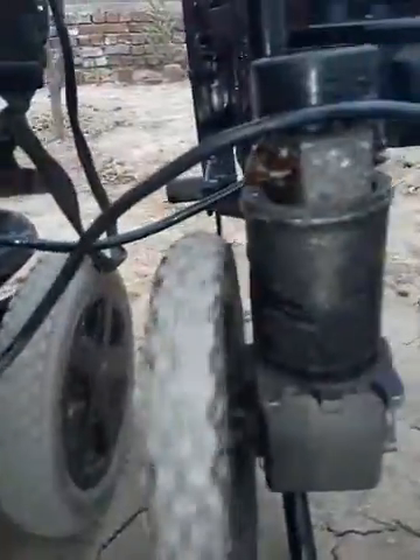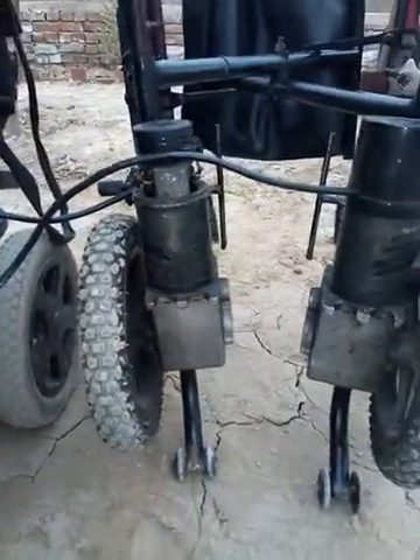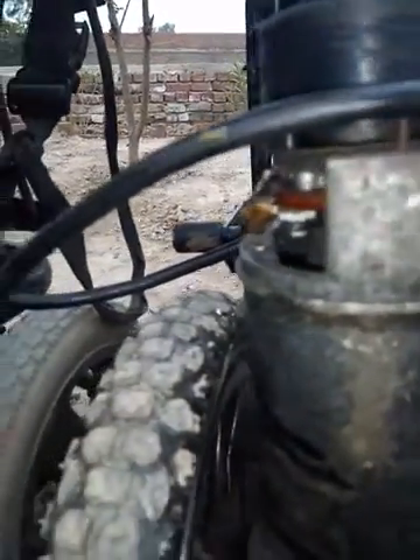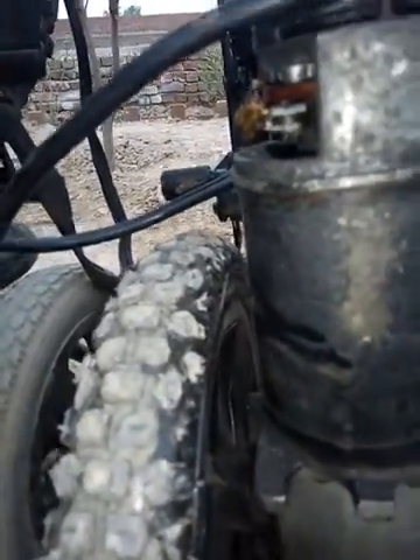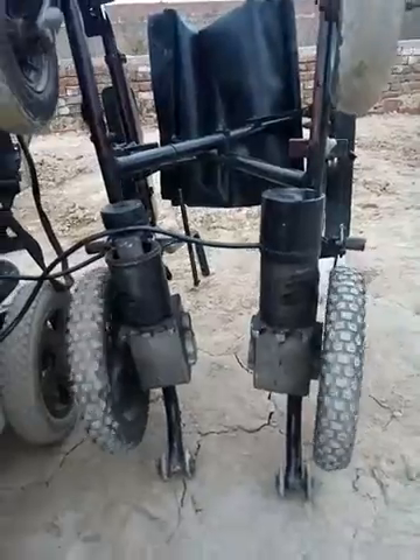You can remove the fault sometimes by cleaning those carbons and checking all the cables with the help of a multimeter, and looking for any disconnection. I have done that — this wheelchair was not in good shape, so it's separating, as you can see.